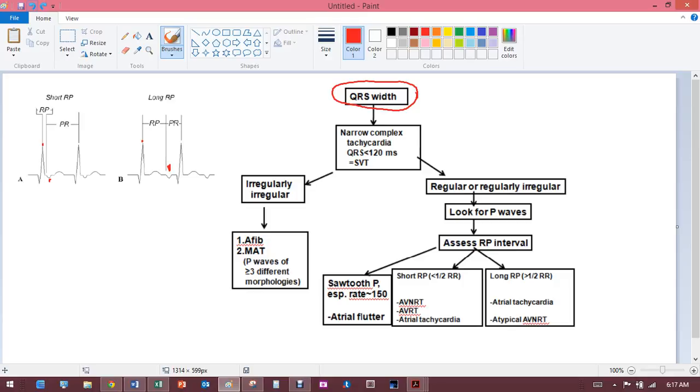It's kind of hard to draw out, but I guess you can look up here more details on it. So next, the regularly irregular. This is an instance where it's irregular, like maybe it's fast, but it's irregular in a regular way, meaning that you can kind of predict when the R to R intervals are going to be at a certain space, all the way through.